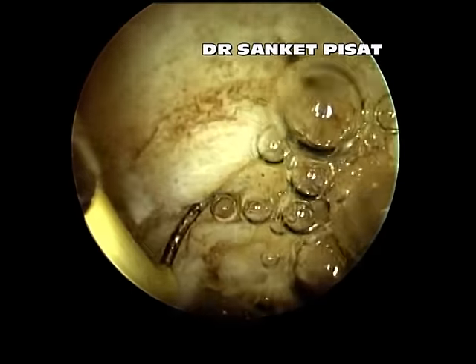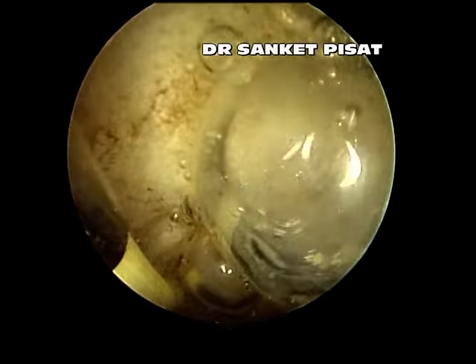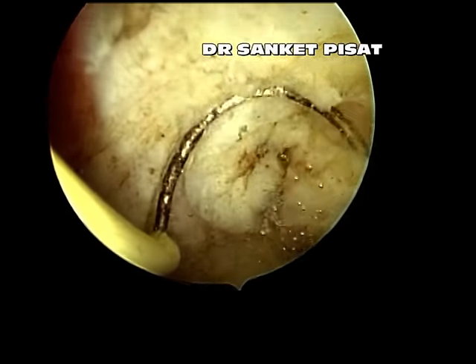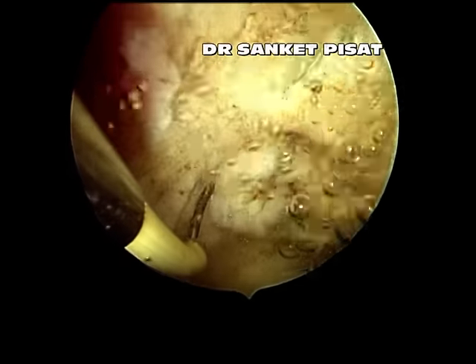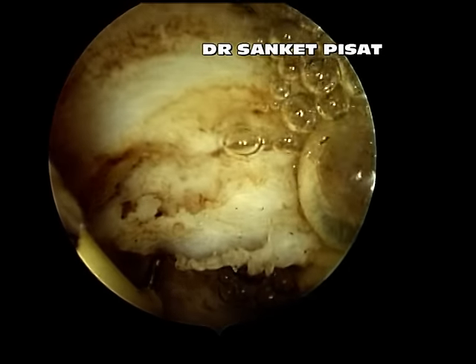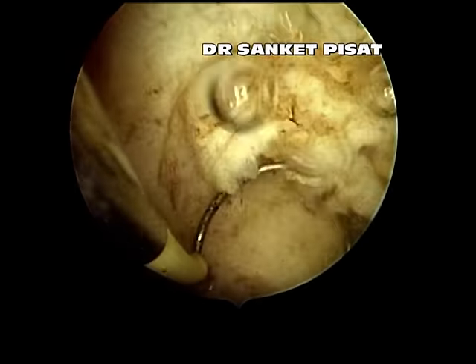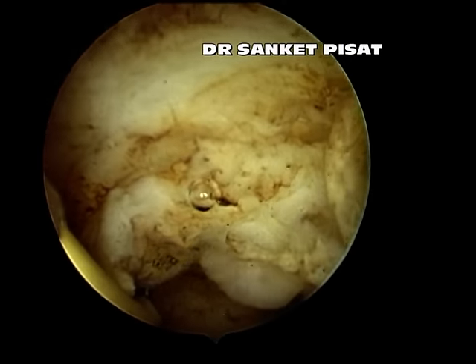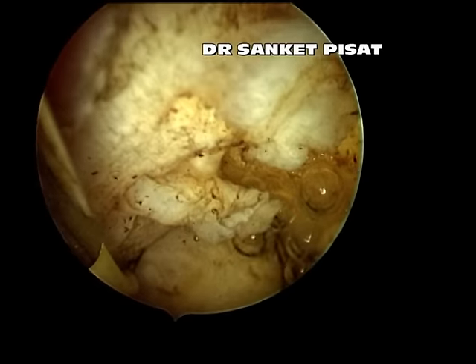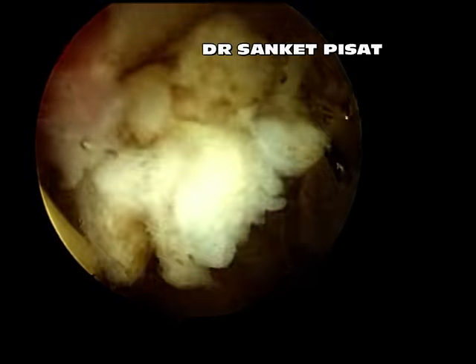Note that conventional myoma resection must always have the activated electrode moving away from the fundus of the uterus and towards the surgeon. The pushing movement towards the fundus must be done without activating the electrode or by activating it in very short bursts only to release the restraining fibers.